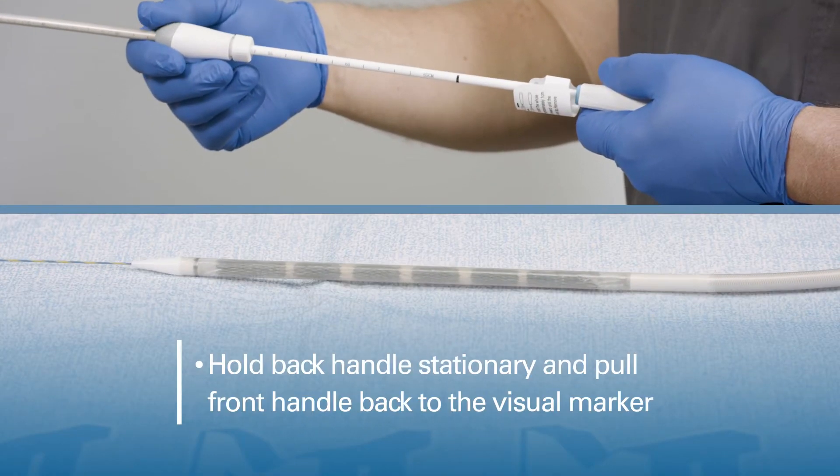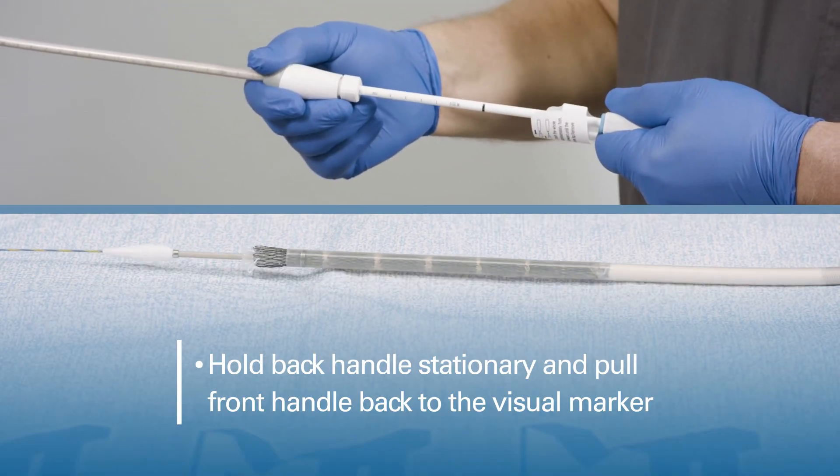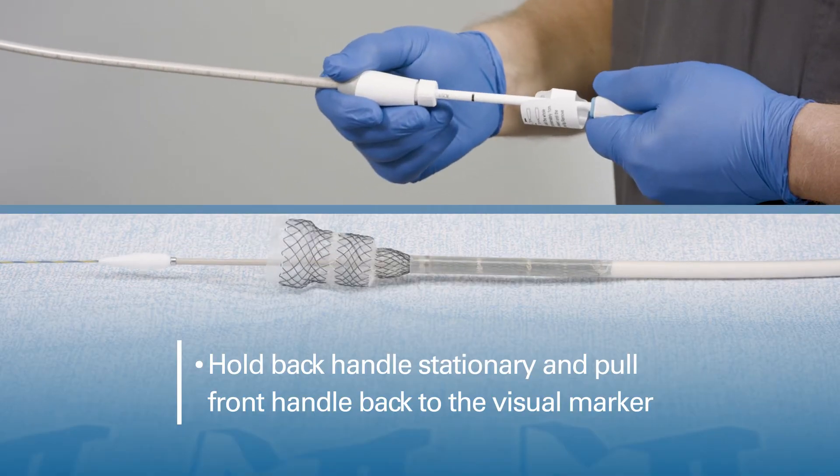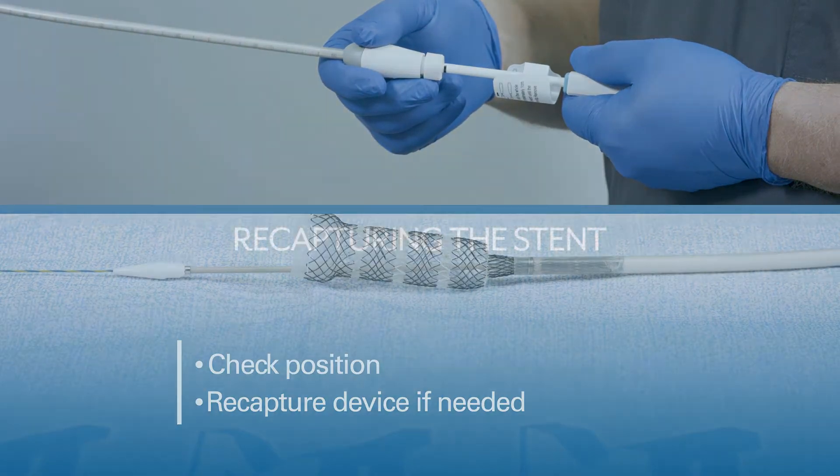Hold the back handle stationary and pull the front handle back to the visual marker. Check position. Recapture the device if needed.